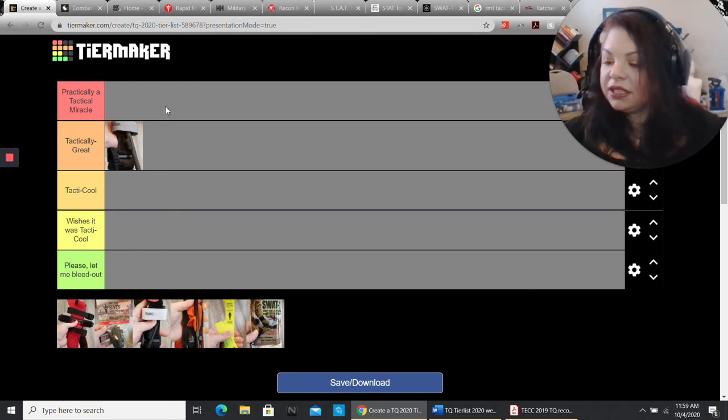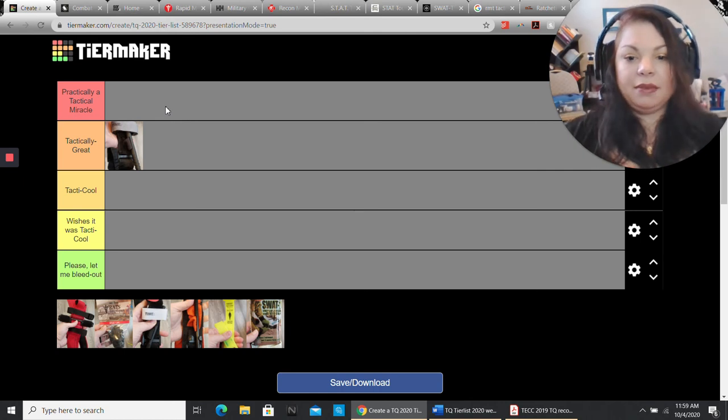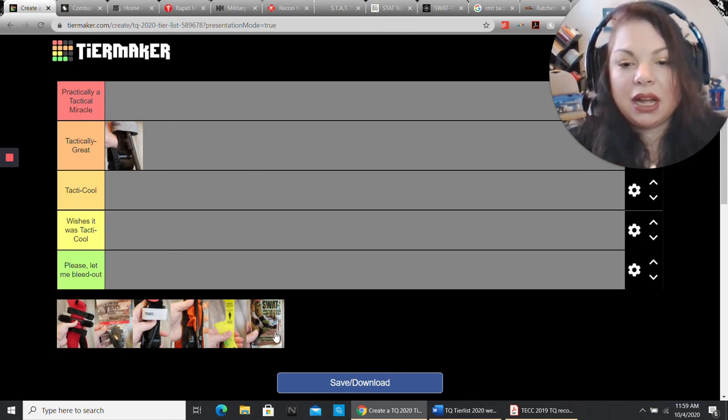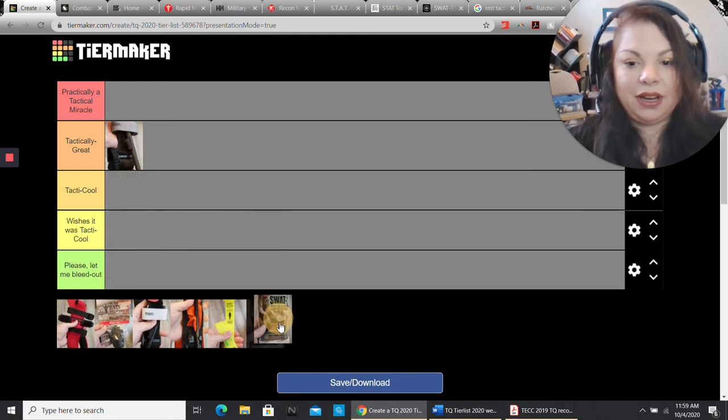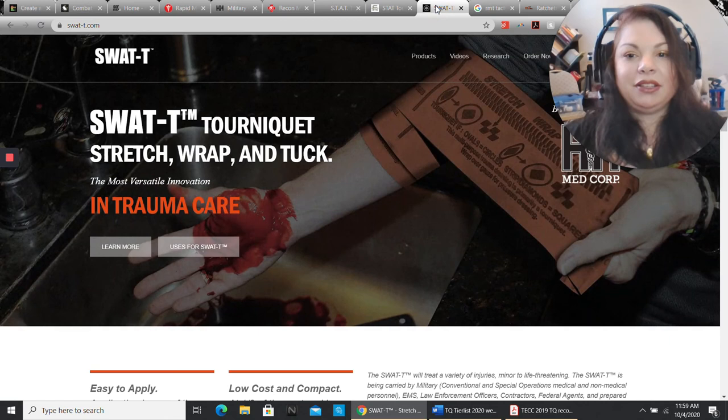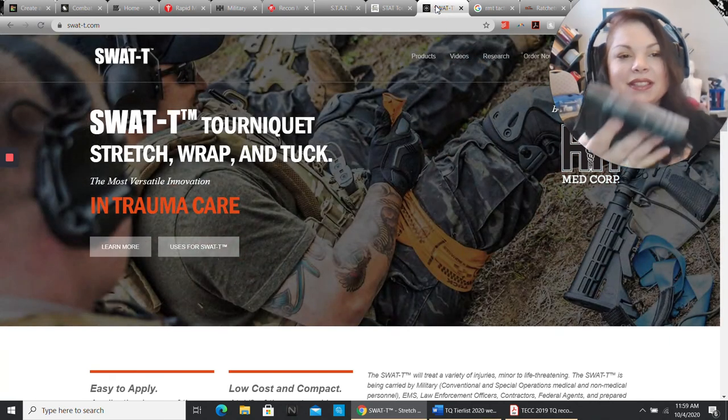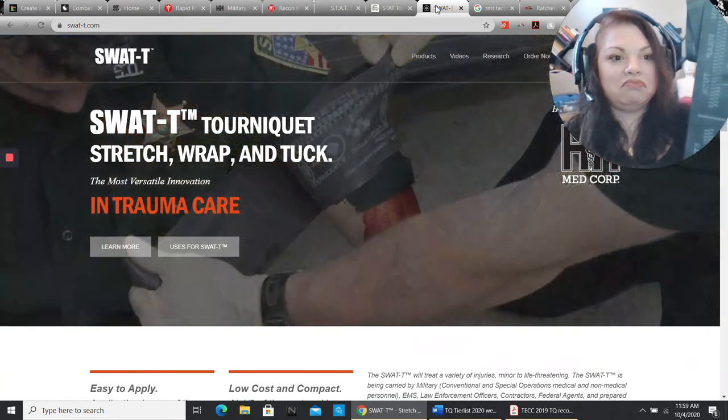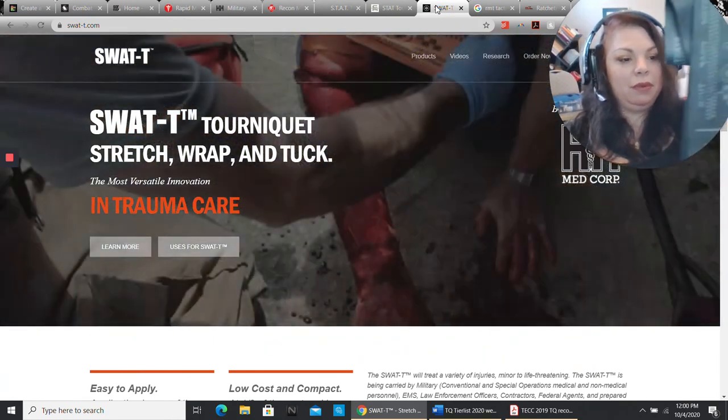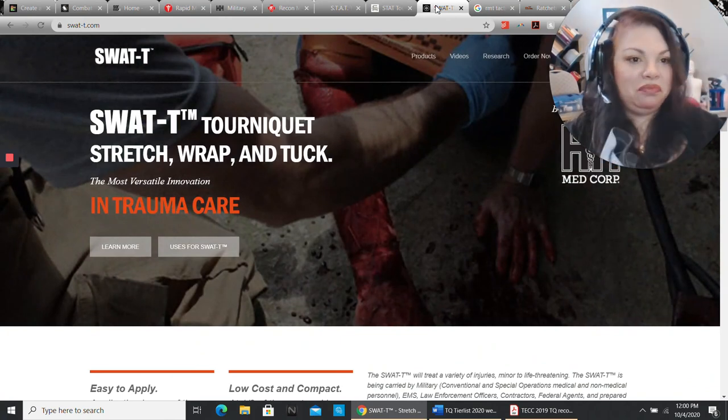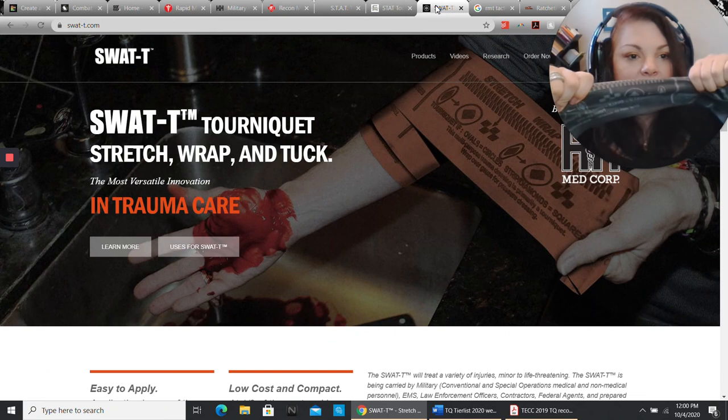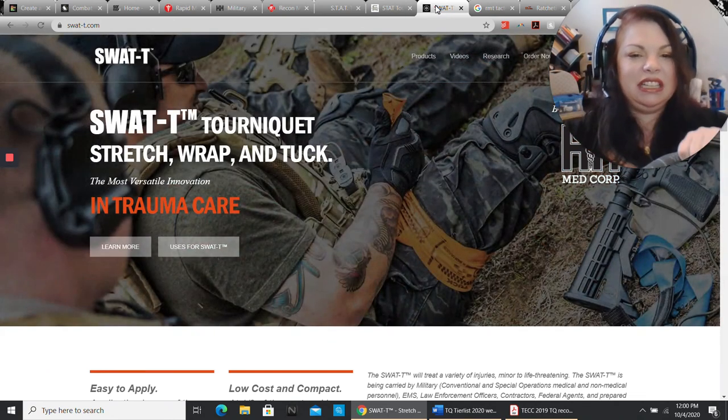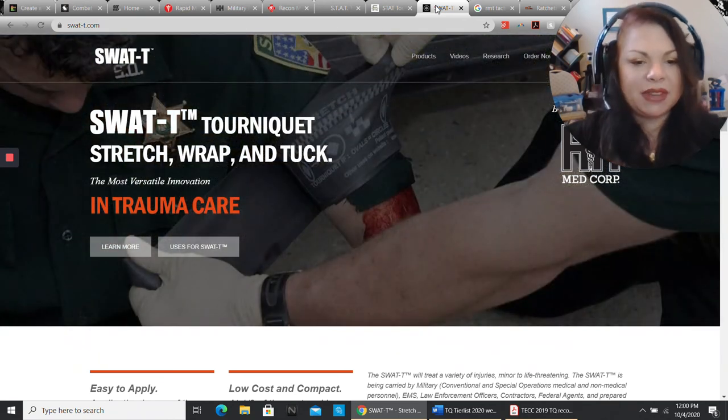Let's go to a different style. I'm going to go down here to my SWAT tee. The stretch, wrap, and tuck. The design is simple. It's basically a gigantic band of rubber. It has a really good idea on it. The instructions are right on there. You wrap it until it's all the way open, then you tuck it in, and you keep wrapping and tucking.